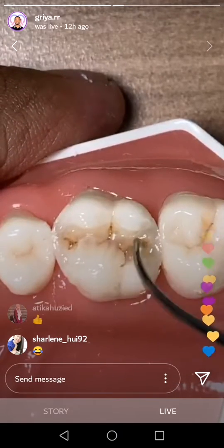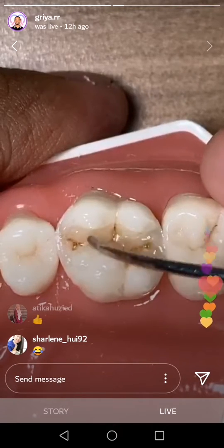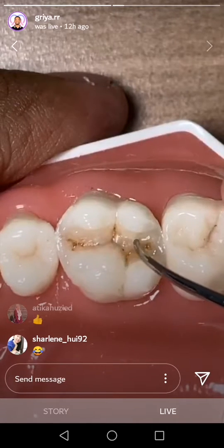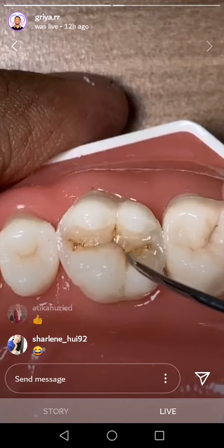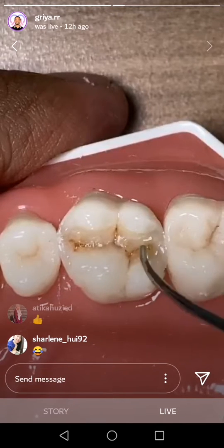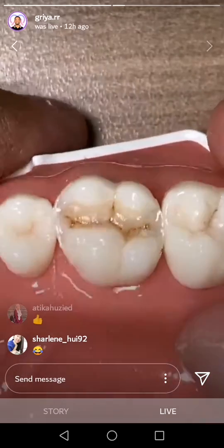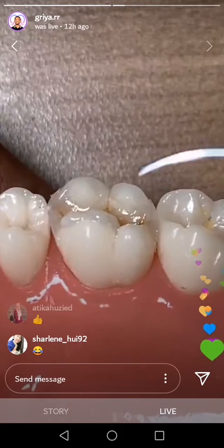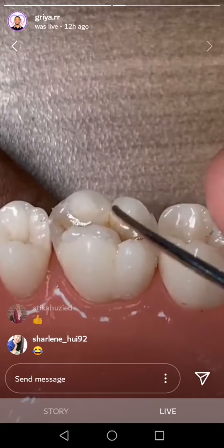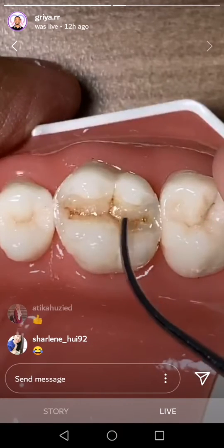Now just fill again. Don't cover this area. Only at the line. Push like this. Push like this. After this, you can see from this side. Oh my God! There is a lot of excess in here. Yeah, because you already pushed like this. Push, push. Yes, that's good. Why? Because if you have excess, you can remove it like this. Remove the excess.